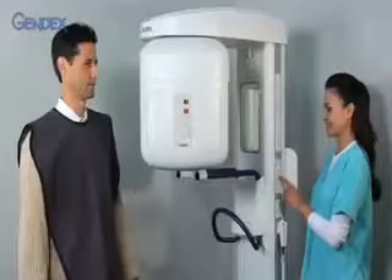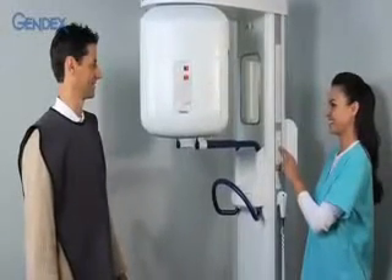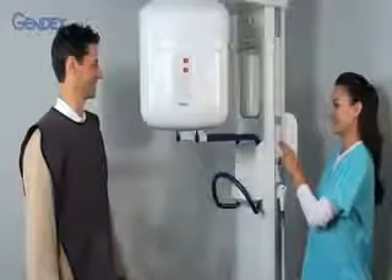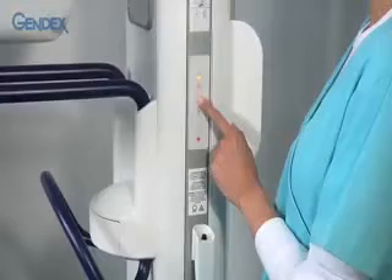Using the up-down buttons on the column controls, raise or lower the gantry to the approximate height for the patient. Additional adjustments can be made with these buttons once the patient is in the unit.